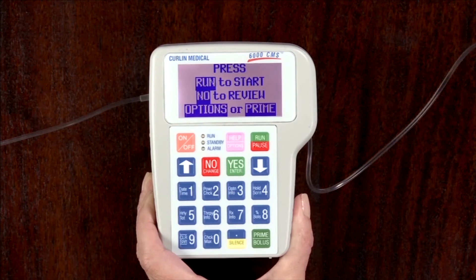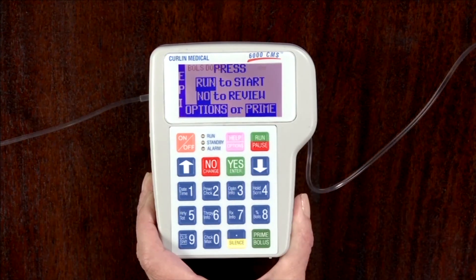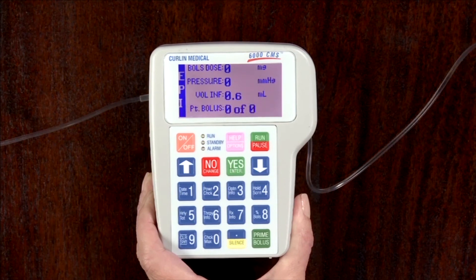Using aseptic technique, connect the administration set to the patient. Press the run pause key to start the infusion. The green LED light flashes when the infusion is running.